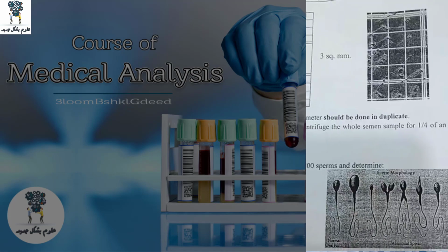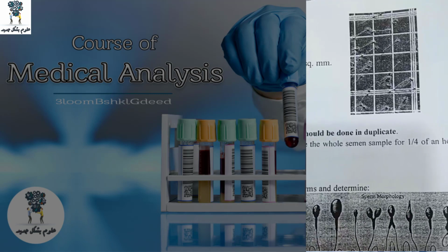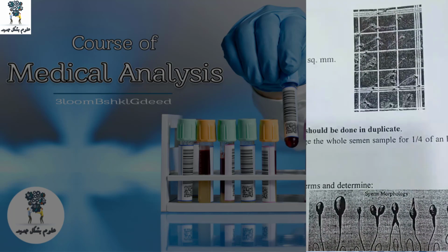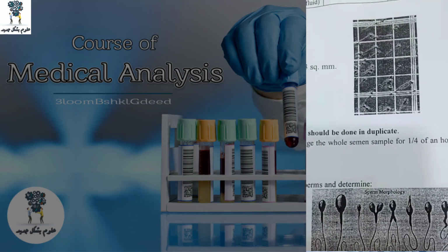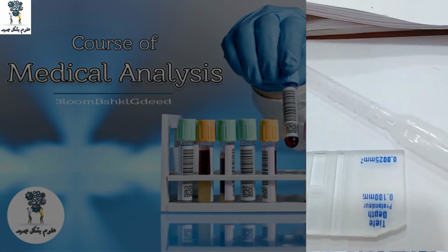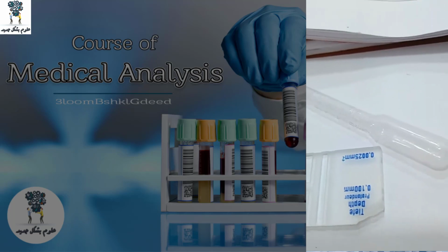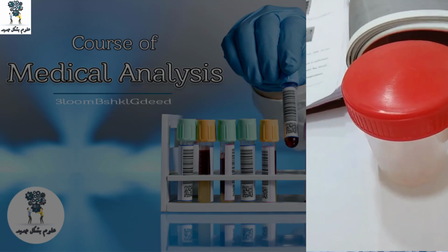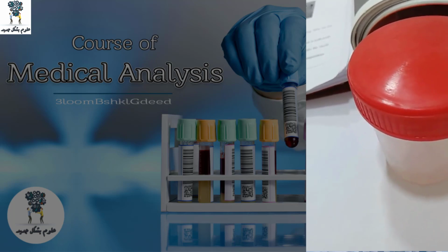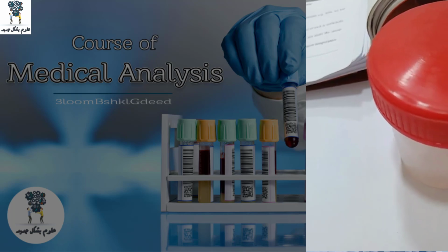So this is a shape that you will see under the microscope. There are different shapes of sperm that may stick together, or they may be normal or abnormal sperm. After that, we have the calculation, and I said we will make the count and total count. When we say count and total count, it is different, as we have different comments that we will see.